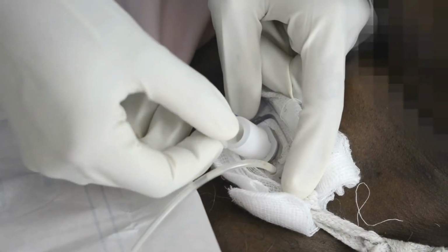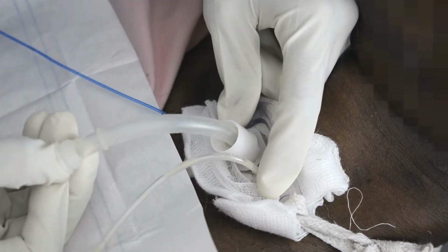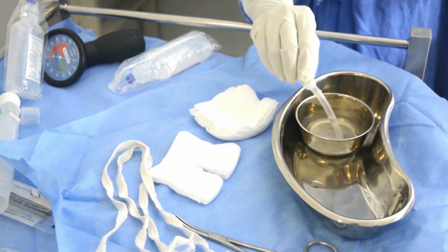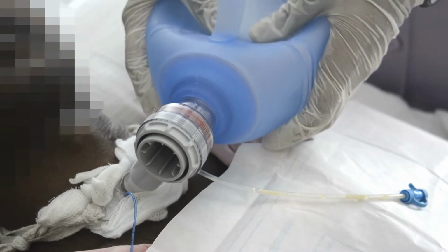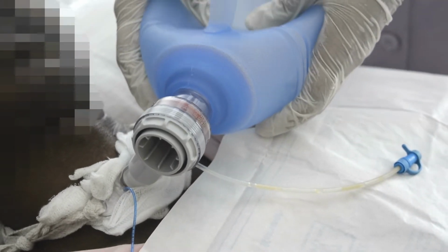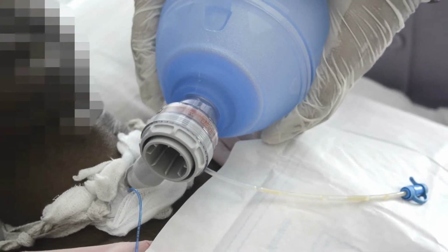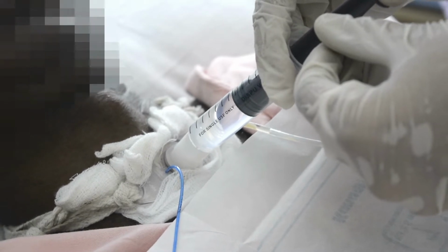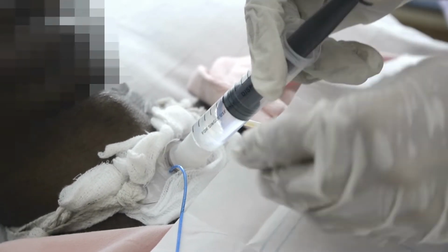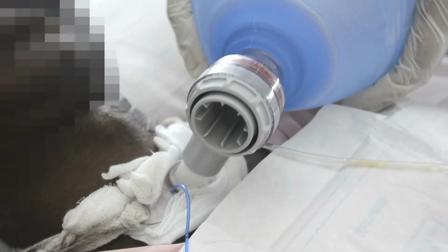Carefully remove the inner cannula, stabilizing it with the other two fingers, and put it in saline, because dried secretions may be there. This is hyperventilating, in a rhythm of press 1, 2, 3, 4, 5, press, like that for 3 repetitions. Then instill the saline, about 2 ml at a time. Again ventilate 1 to 2 times with the ambu.